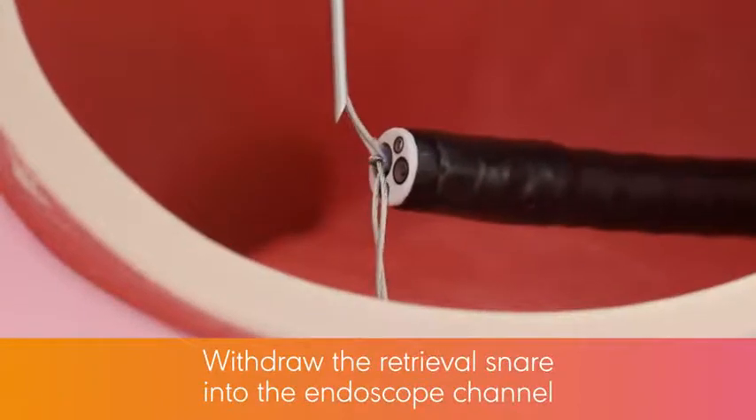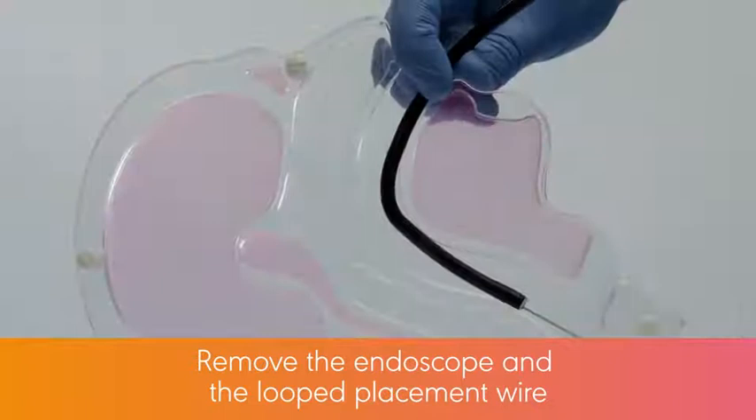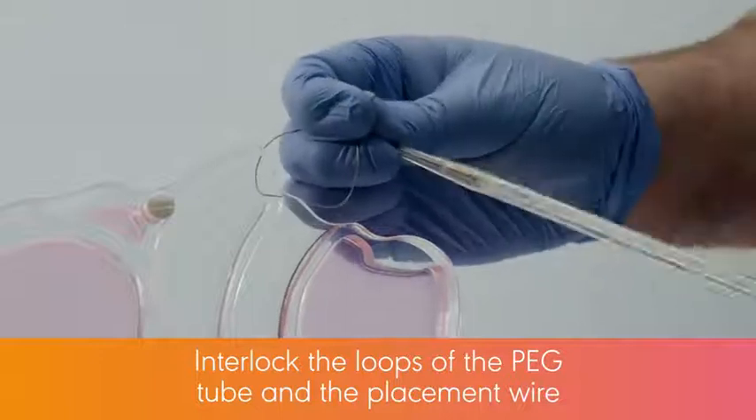Withdraw the retrieval snare into the endoscope channel. Remove the endoscope and the looped placement wire through the oropharynx. Pull approximately 5 inches or 13 cm of the looped placement wire from the mouth. Interlock the loops of the peg tube and the placement wire as shown.